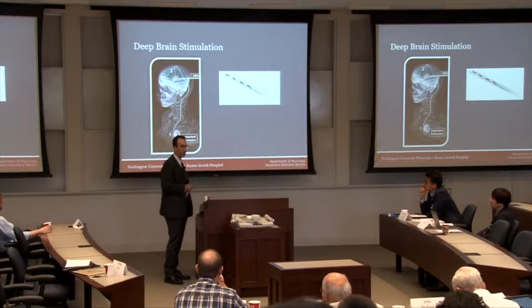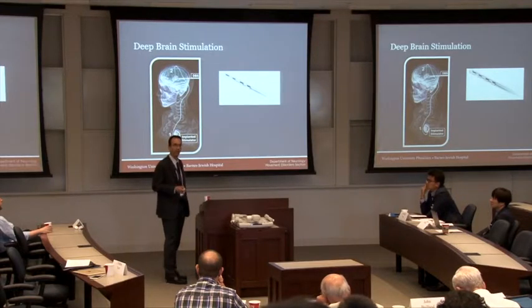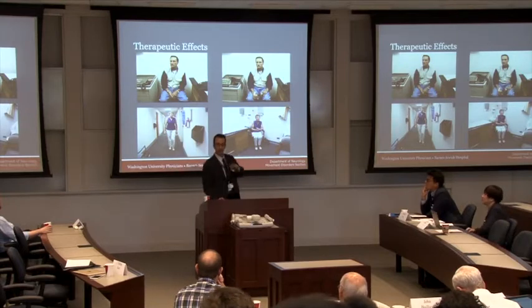Patients with this device come to me periodically, once a month, once every 6 months, for tune-ups, because these are for diseases that continue to progress and require adjustments as an open-loop system currently. So I've got a couple examples here.